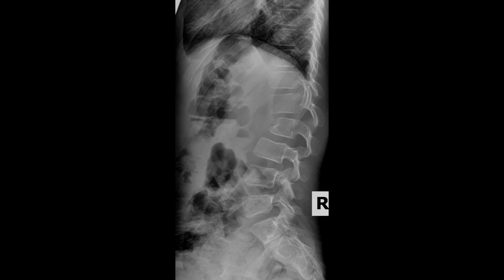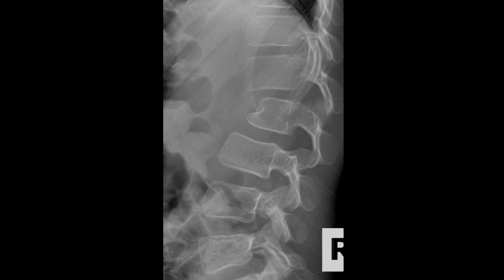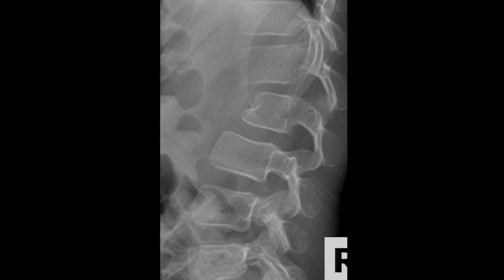Here is a lateral radiograph of a pediatric lumbar spine. This abnormal appearance to the anterior aspect of the L2 vertebral body is due to a congenital absence and is called a dorsal hemivertebra.